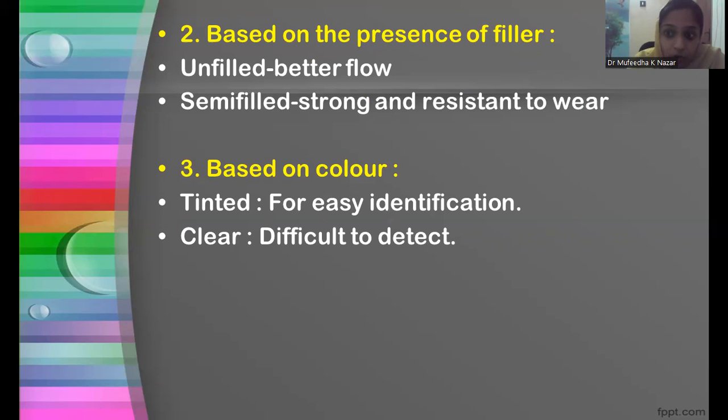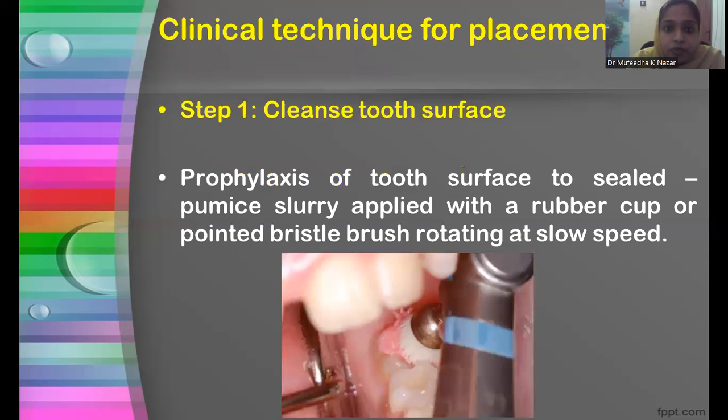Colored sealants are more advantageous than the clear sealants because it is easily appreciated by the patient and can be monitored by the dentist at the subsequent recalls. And thus, the sealant loss can be easily assessed by using colored sealants.